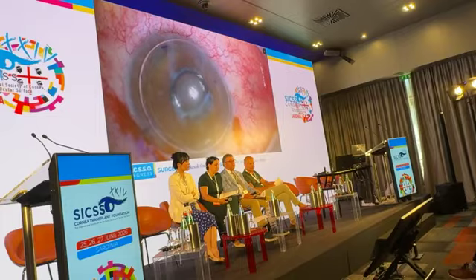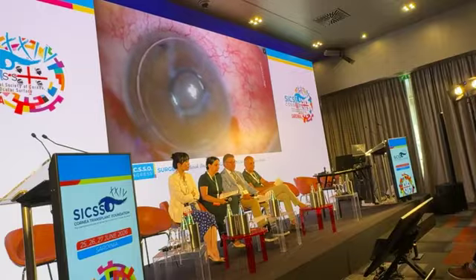Okay, so now he will start the preparation of the donor tissue. The donor tissue that he will be using comes from the Venice Eye Bank. The donor is a 71-year-old female, and we do have 2,600 cells per square millimeter, and the morphology of the cells is good.